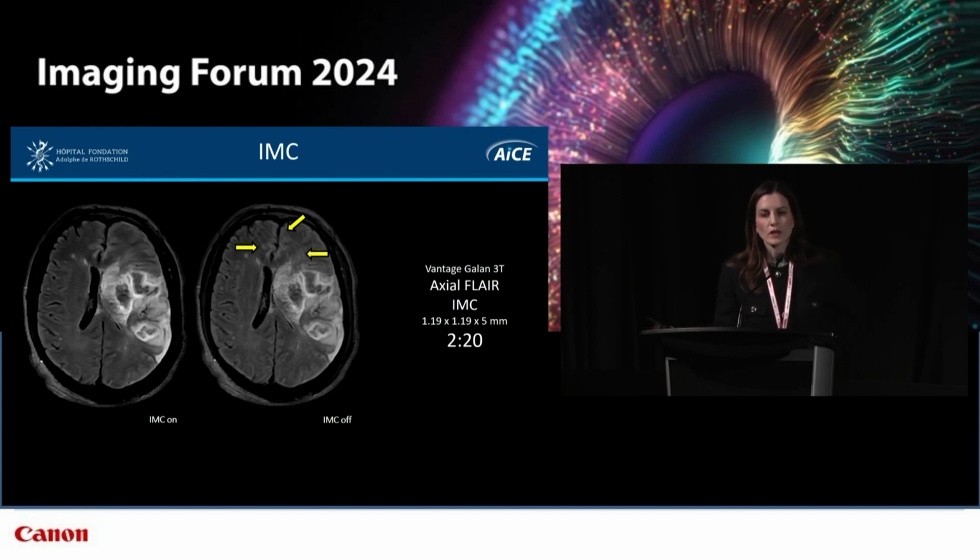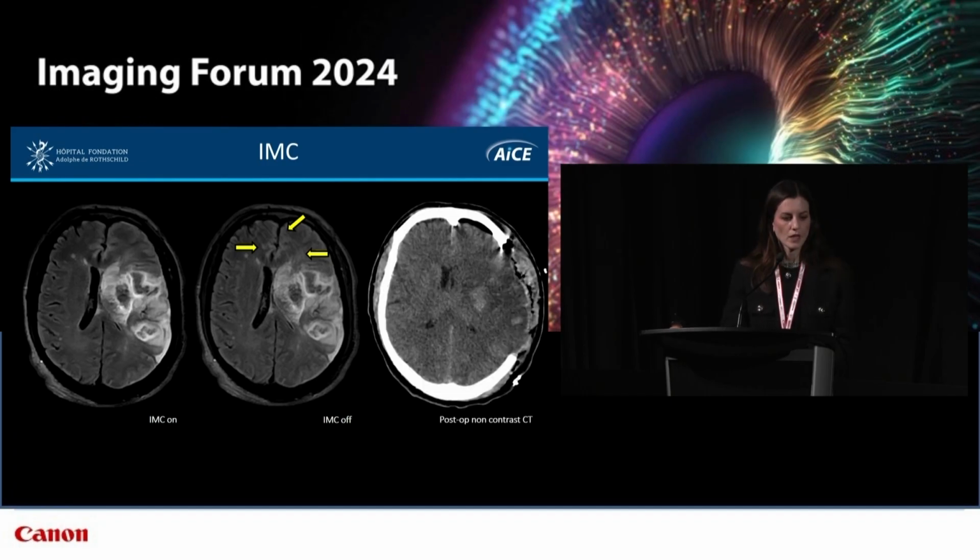So, I mean, that's all well and good, but why exactly is that so important? We need to be able to reliably calculate the volume of this infarct, as this has major repercussions for the patient. And if the infarct is over 145 cc's, the neurosurgeon then has to bring the patient to the OR for decompressive hemicraniectomy as a preventative measure for the impending edema. And that's exactly what happened to this patient. This is his post-op CT showing no further midline shift.